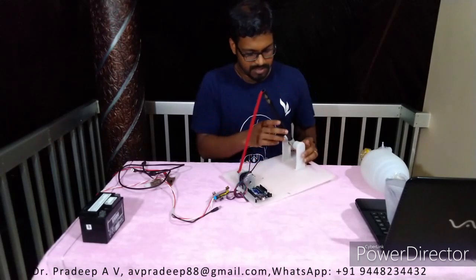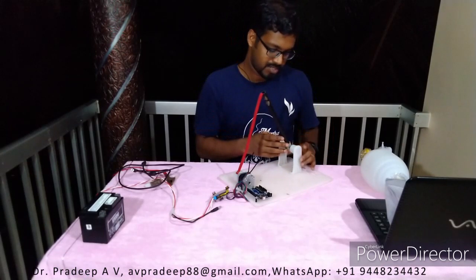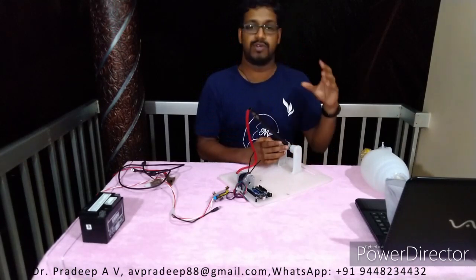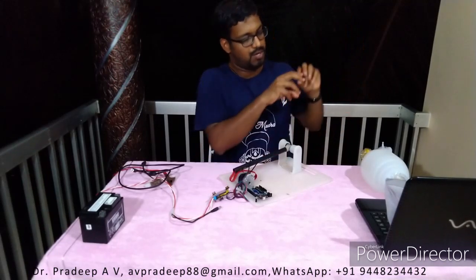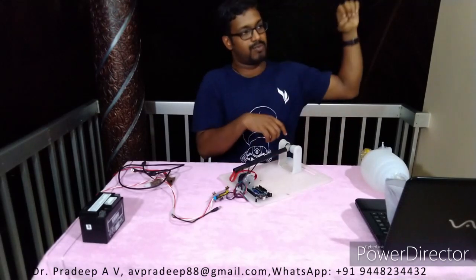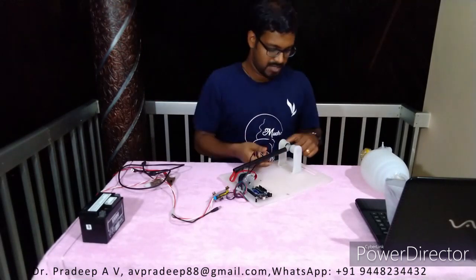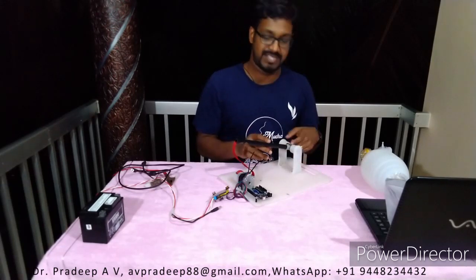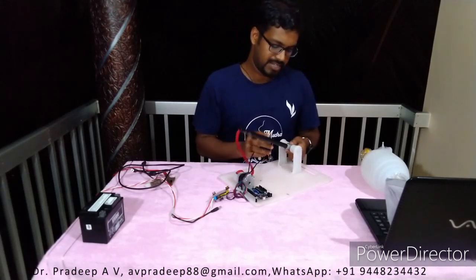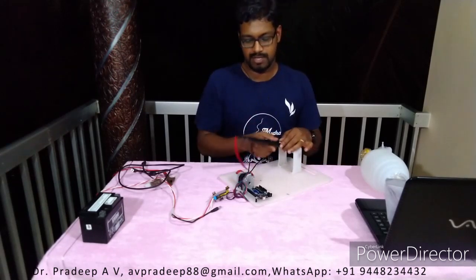And here are two stands. Basically, this is what we use for mounting curtains to this window. You mount one stand on one side, the stand on the other side, and you put the rail and mount the curtain there. The same thing here. This is a wiring PVC, and this is a wiring PVC T. So I connect a T here and just another PVC here, so that I can have this motion.